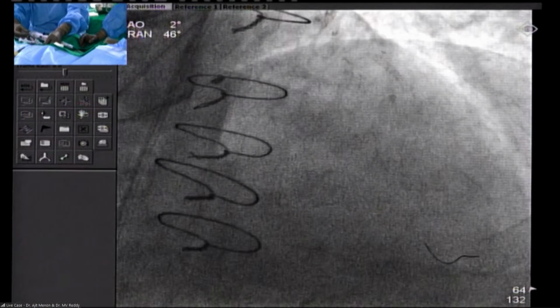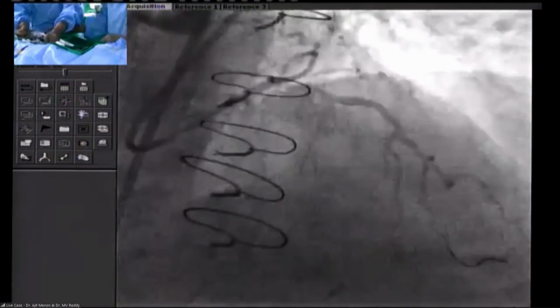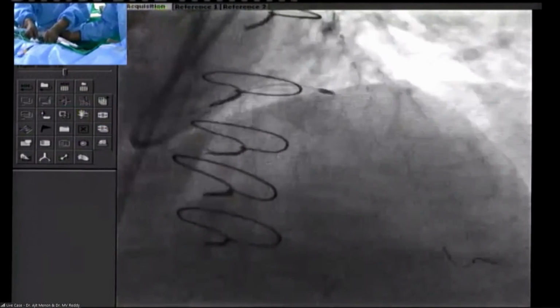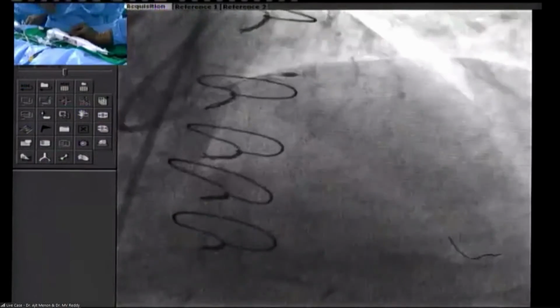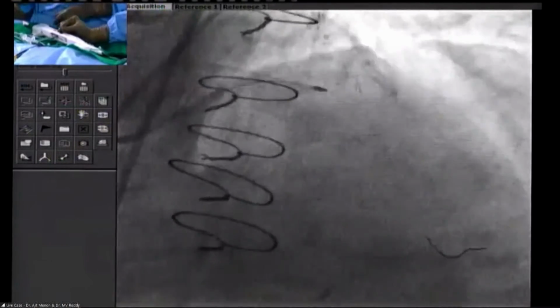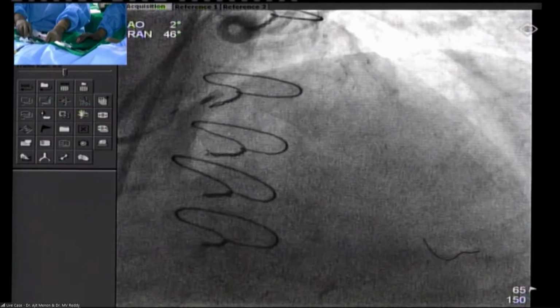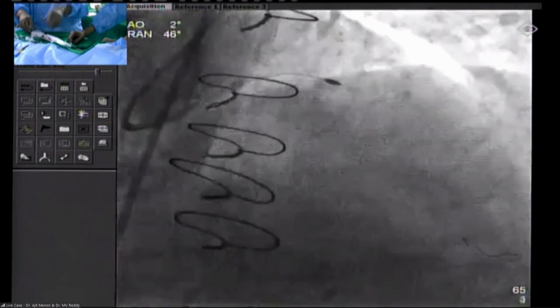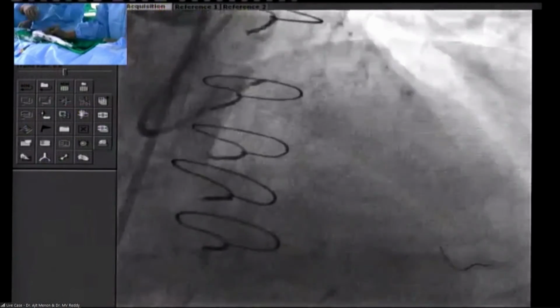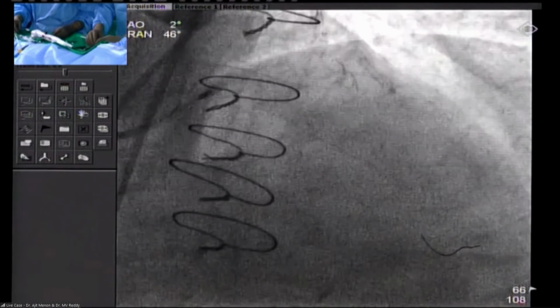Give me a small test. Small test. Okay. So we generally practice a very slow method of rotablation, not the fast checking side. And we normally keep our speeds at about 170 to 180,000 RPM. So I think that's a decent cut.